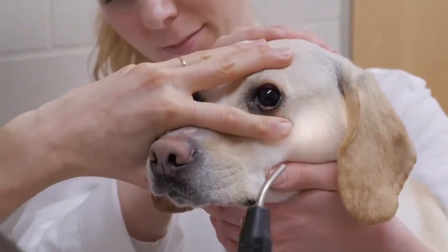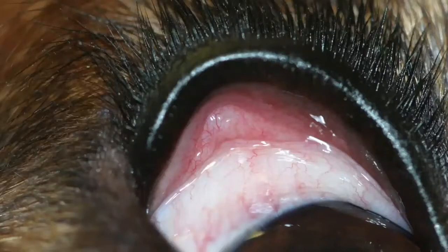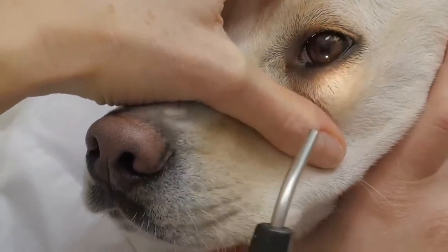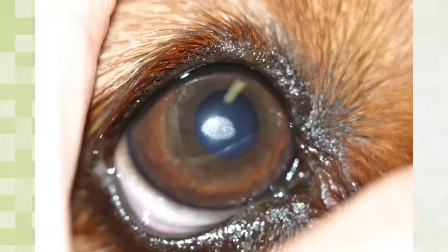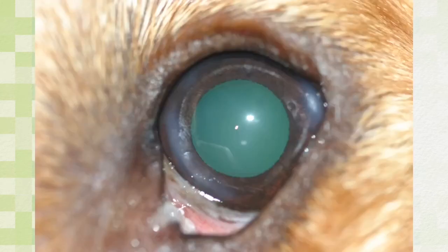Sclera and episclera. Underneath the bulbar conjunctiva lies the episclera, an anterior aspect of the sclera. The clinician should examine these structures for changes in color, thickness, or for masses. Corneal examination. Using the transilluminator, the cornea should be examined directly and at various angles for defects, loss of clarity, changes in the curvature, or changes in size. Opacities should be characterized by their shape, number, texture, and location.